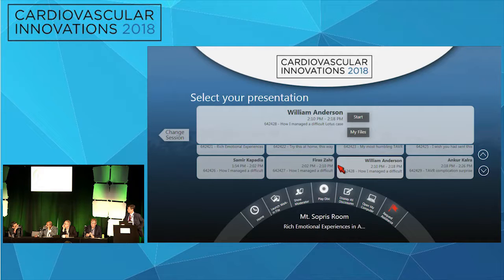So if you measure the height, and if it's less than 16, the STJ, then it won't come out. So these days, what I do is I put a guide liner in all patients. And if you're not 100% sure, you can put a balloon and then cross back from the S3. So at least the stent will be straight and not chimneyed, because this way the stent will be chimneyed. So those are, but it's a controversial area.